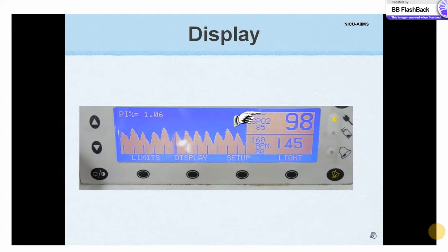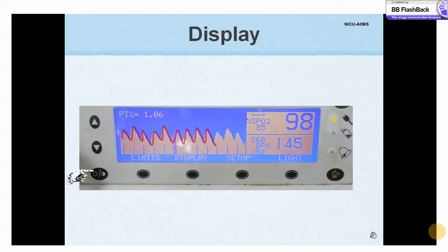This shows the oxygen saturation of hemoglobin, and both panels show the limits set by the operator. This is the plethysmographic waveform, which automatically scales to the perfusion level or strength of the signal being received at the monitoring site. The brightness and contrast of the display screen can be adjusted using these buttons.